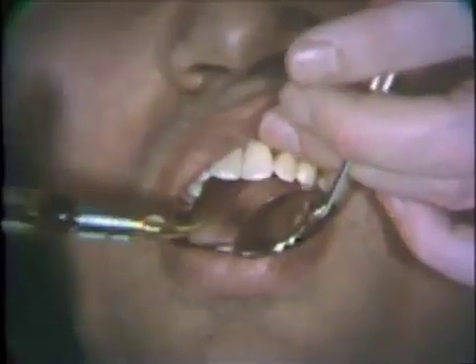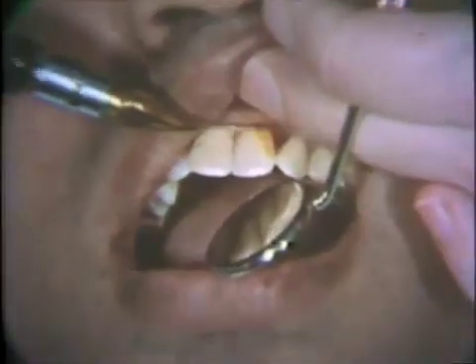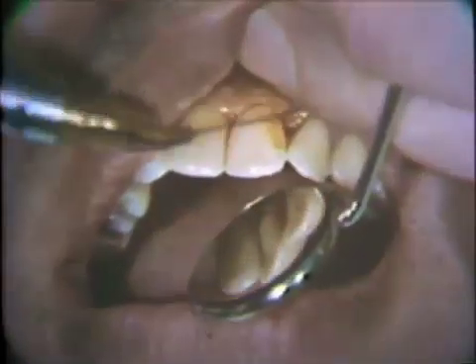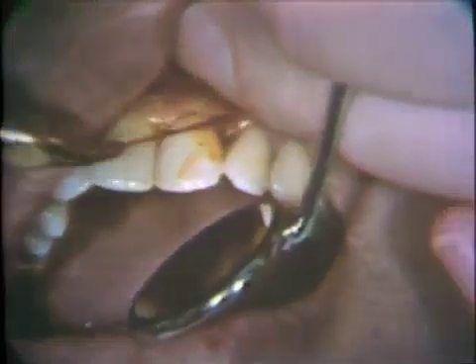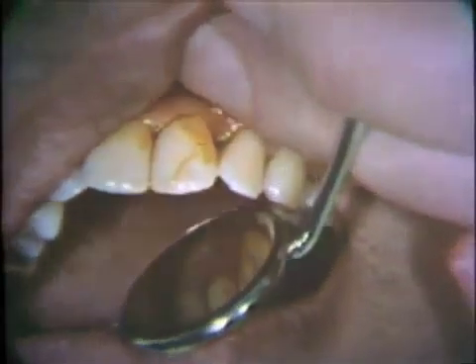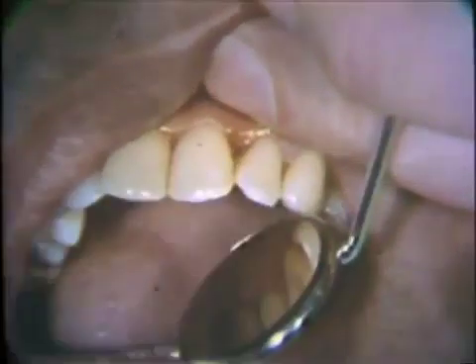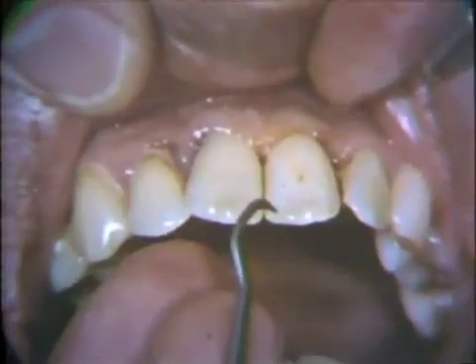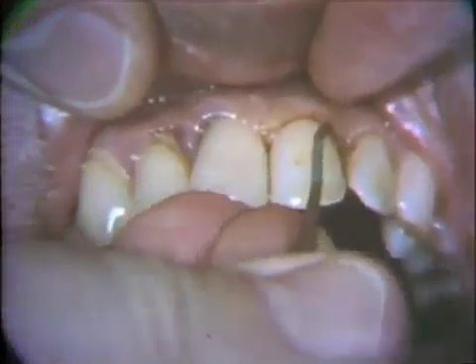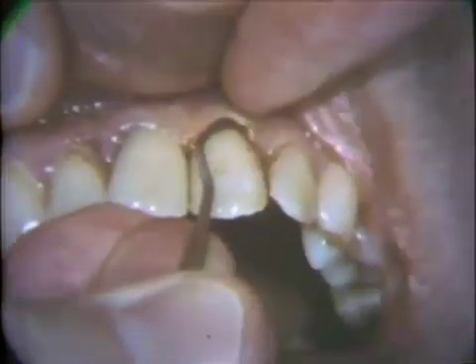The scaling procedure will now be demonstrated on the central incisor. First, the operative site is flooded with iodine lotion. A sickle scaler is used to remove the labial and interproximal calculus.